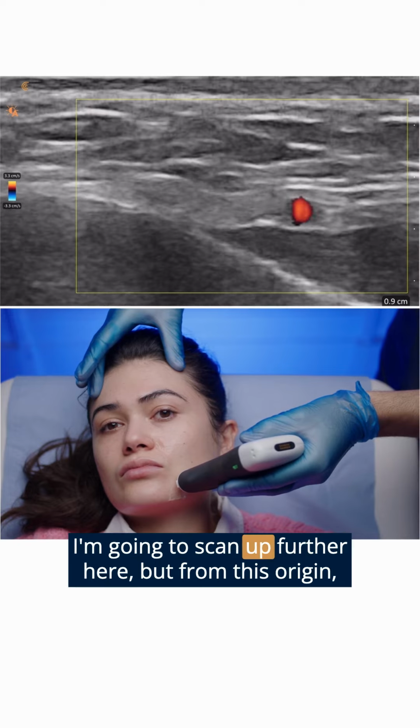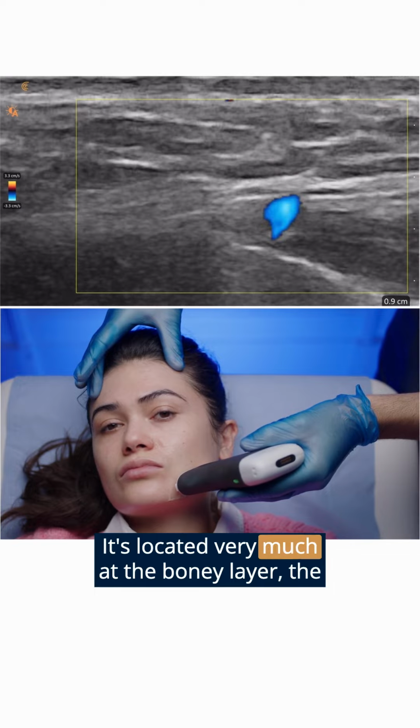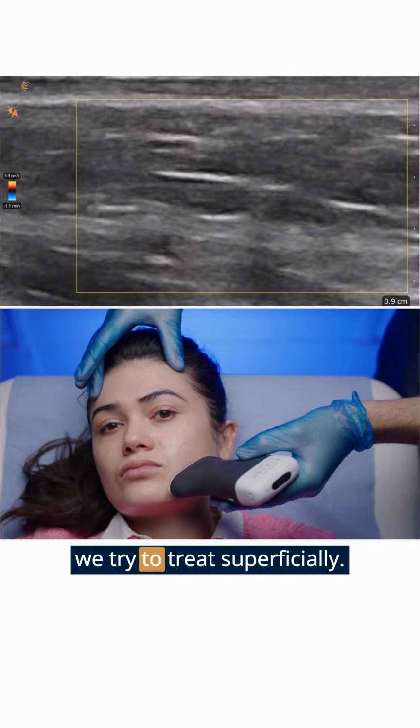I'm going to scan up further here, but from this origin you can see it's quite deep. It's located very much at the bony layer, the periosteum, which is why when we treat jawlines we try to treat superficially.